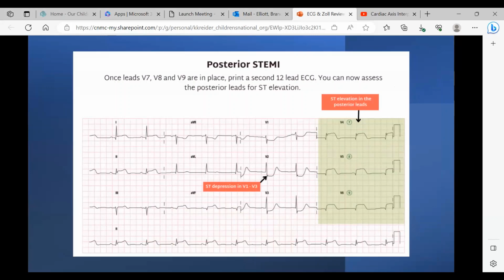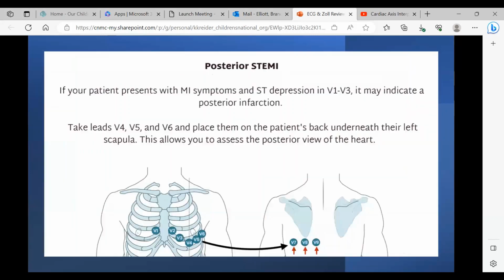Yeah, if you want to go back two slides, to where that picture was. That one right there? Whenever it calculates all these things, it's very important to have proper positioning of all your stickers. The whole program is designed based off exactly where on the body the stickers are located, where the normal heart sits. So it's important to get the actual positioning of the stickers correct.